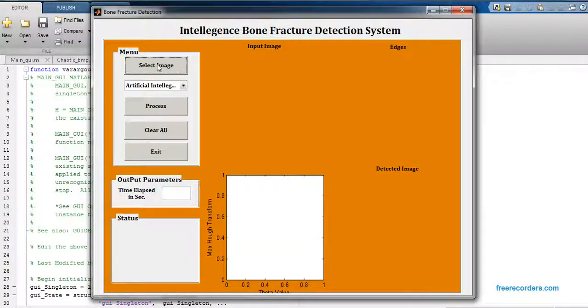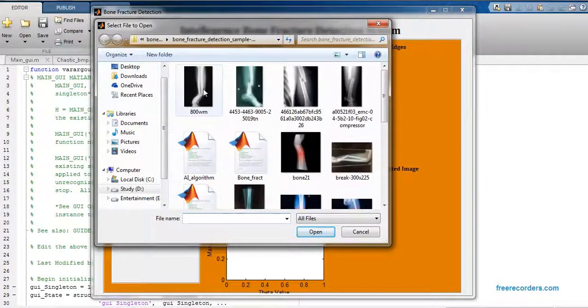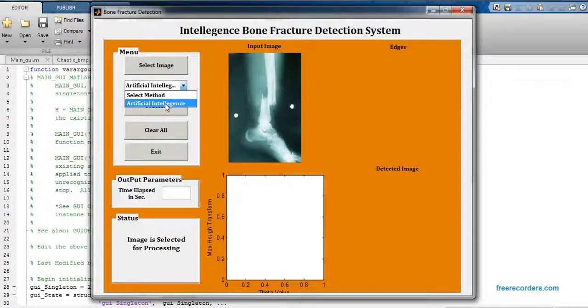I just want to run this code for one more image. Just click on open, select same method, just click on process.